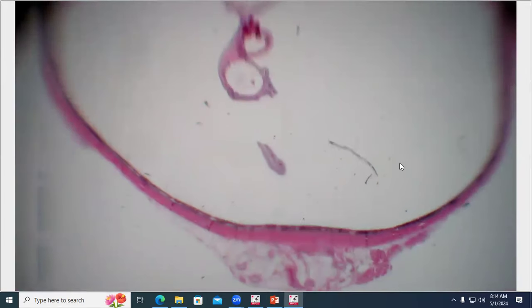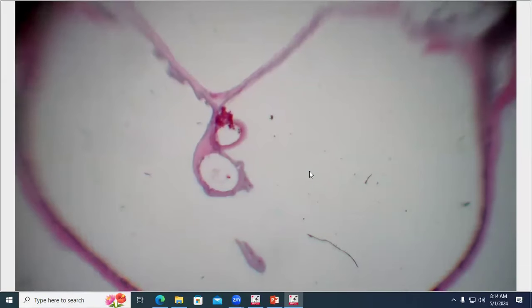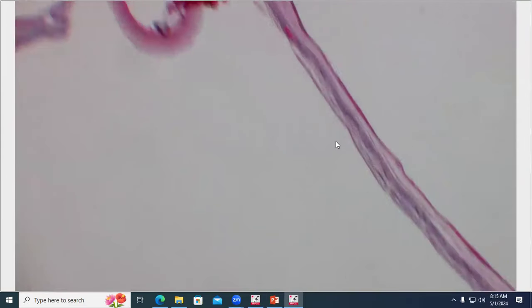So the lens capsule isn't completely sampled, but we can see that here's our lens capsule here. Again, empty of lens fibers. We can get some of our retina coming in through here. It's a little bit tangential at this level. And we have this sharply demarcated hole in the retina, which is where our foreign body passed through. And then the foreign body itself sampled kind of wonky and is flopped out on one side here, but at least sampled and visible. So now let's take a closer look. Again, to orient you, cornea to the right. And we're going to, without further ado, pass right back to the foreign body.